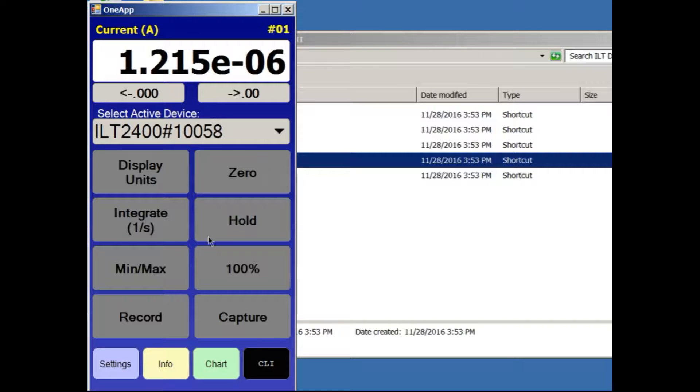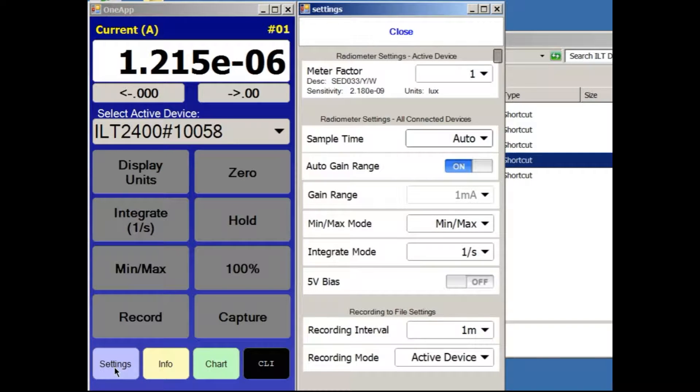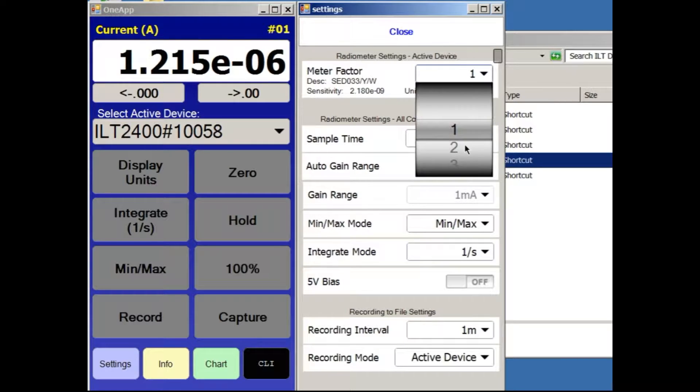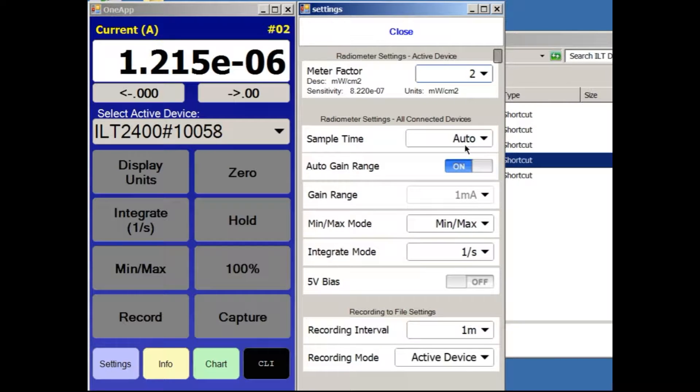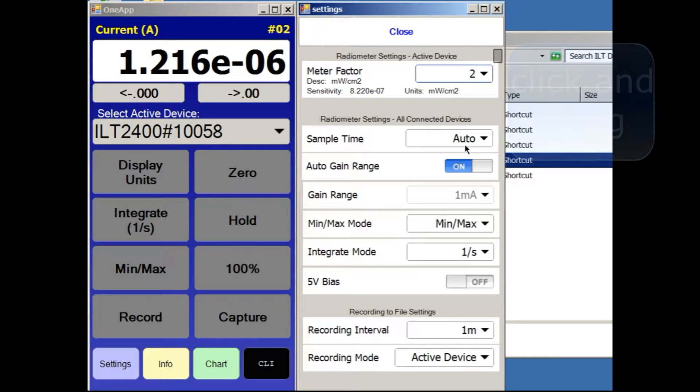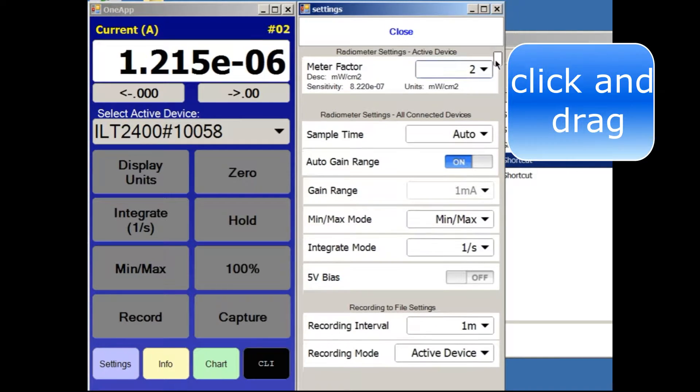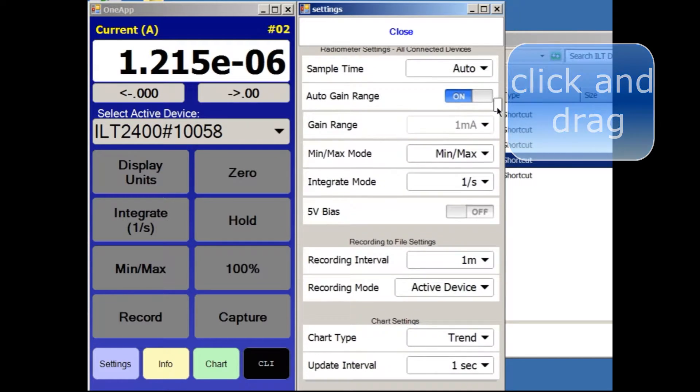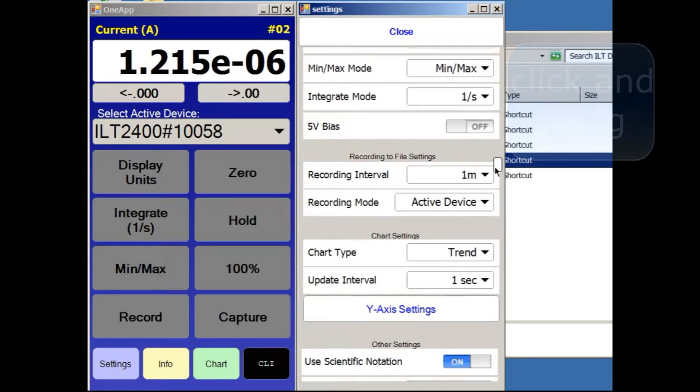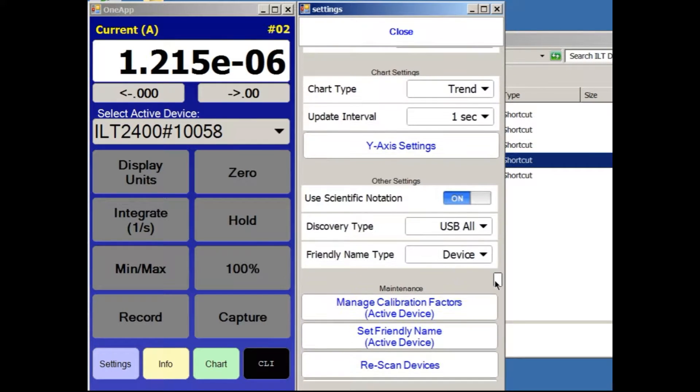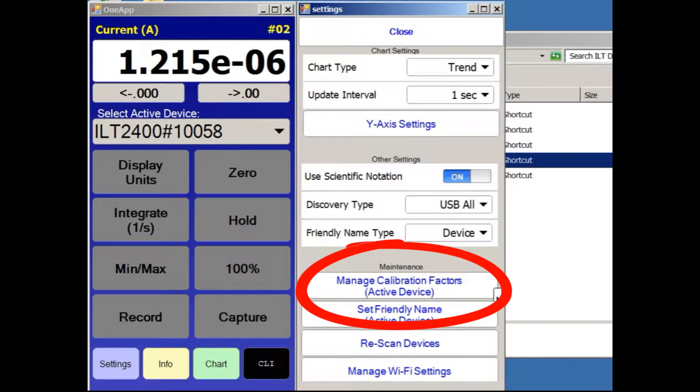To add a calibration factor, click on the Settings button. Pre-programmed calibration factors are selected using the Meter Factor button. However, if the factor has not already been stored, scroll down to the Maintenance section and click on the Manage Calibration Factors button.